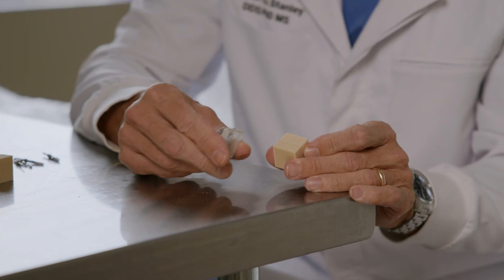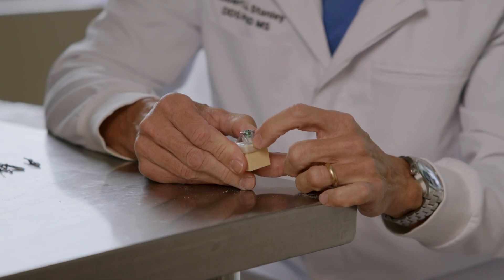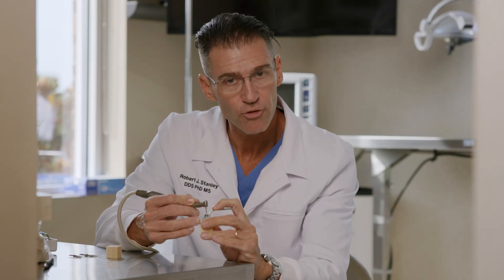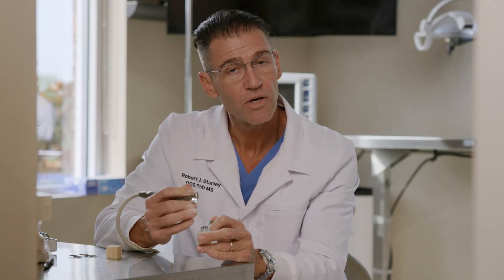Now let's go to our guided attempt. The first step with the guided protocol is to insert the guide with the viewing window towards the dense foam. We must ensure it's fully seated — I can look at the viewing window to confirm it's down all the way. It's color-coded, telling us we're going to use the green protocol because it's green on the top. We insert our guide sleeve in, and just to be fair I'm not going to hold it on the table since I wasn't holding the first one on the table. We simply drill down through the guide.